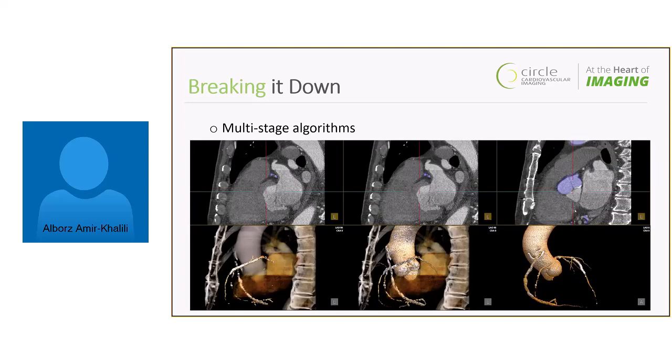Another thing you should keep in mind when doing multi-stage processing like this is to always link the detection back to the original signal intensities. One common mistake is that people apply post-processing on the mask space alone. To do refinement, they only pass in the prediction from the previous network. I personally believe it's always important to maintain that connection to the original signal intensity, and this essentially allows you to keep the fidelity to the original data and also to be able to handle the noise that could be injected from the previous step.